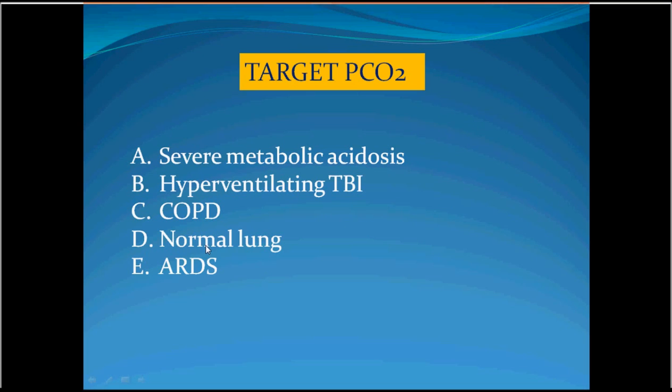A patient with COPD, with acute-on-chronic exacerbation of COPD, retains more carbon dioxide and comes with a low pH. In this case, you have to adjust the pH of the patient. You wash out the added carbon dioxide in order to bring the pH back close to 7.35.